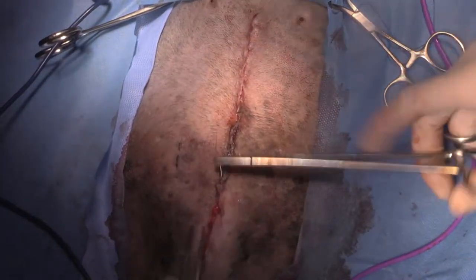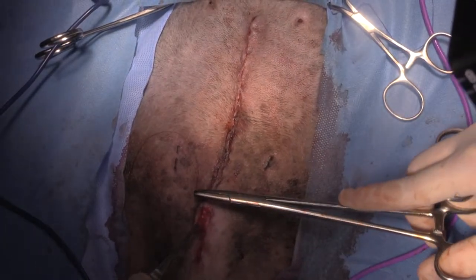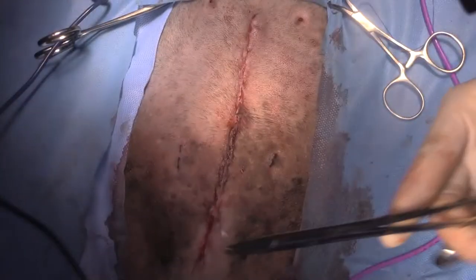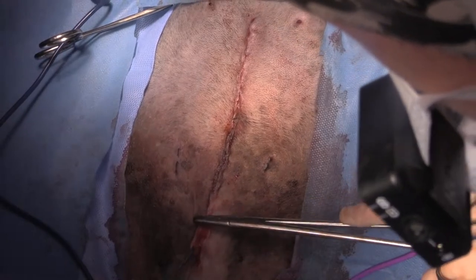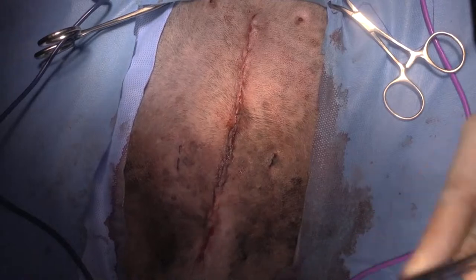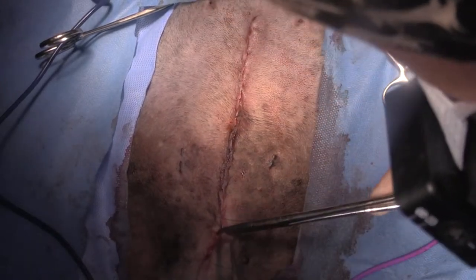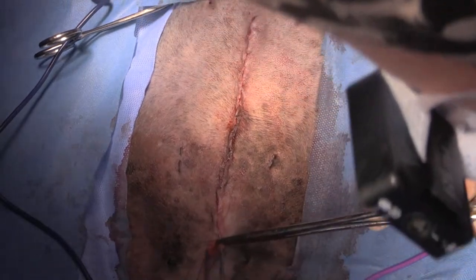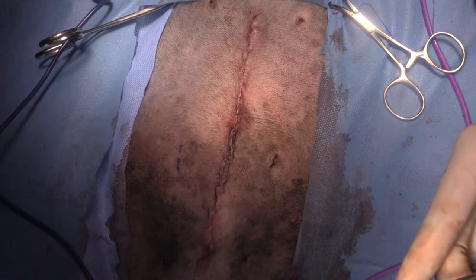Another question: what would you do if by mistake you end up rupturing the gallbladder while placing your stay sutures and tucking? So that's not too big of an issue. The vast majority of these gallbladder mucoceles are going to be sterile, so we're not going to be dealing with infectious agents that could be coming through, like we would if, for instance, we'd gone into our enterotomy and had intestinal contents come through. But the bile itself can be irritant to the abdomen. But again, as long as we get onto it quickly enough and we can clean up the abdomen quite nicely, you can actually perform cholecystotomies and just open up the gallbladder and then re-suture the gallbladder if required. And it's not going to come rushing out particularly.